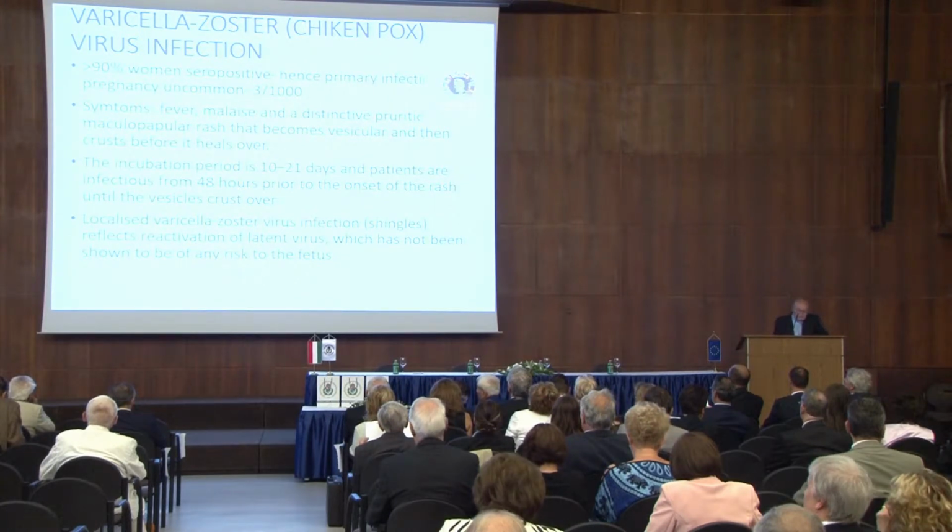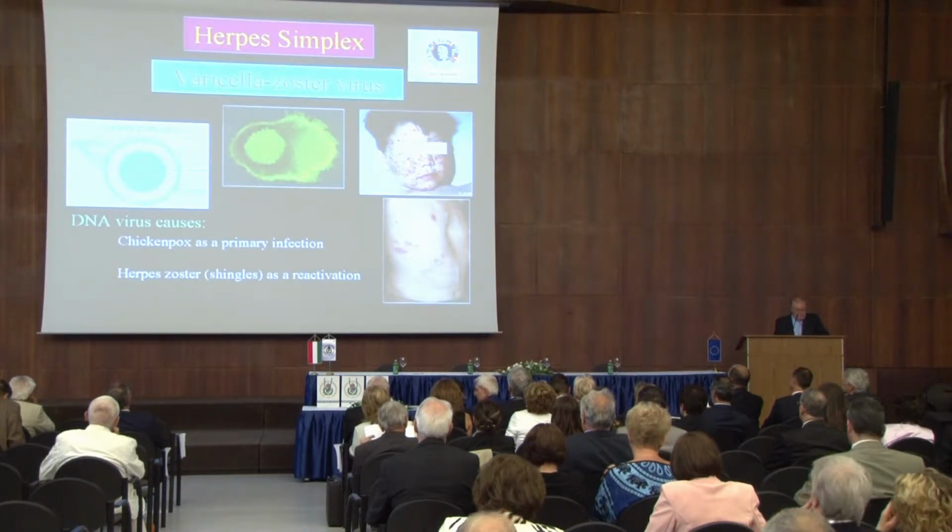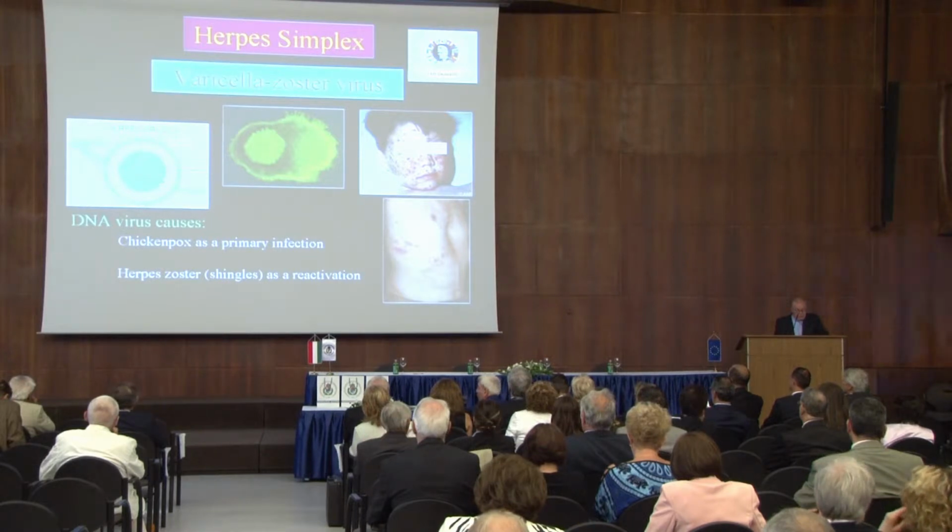Varicella zoster and recently Zika virus have significant influence on the infection. And just to say that congenital varicella syndrome is characterized by limb defects and limb hypoplasia, where again ultrasound is the method of choice to detect it antenatally. Here are some illustrative pictures of neonates, and ventriculomegaly, hydrocephaly, echogenic bowel, almost the same signs as in other infected fetuses or mothers.